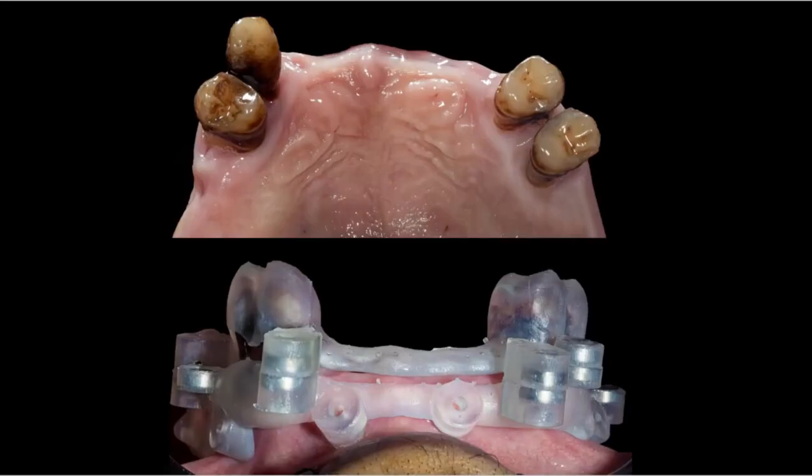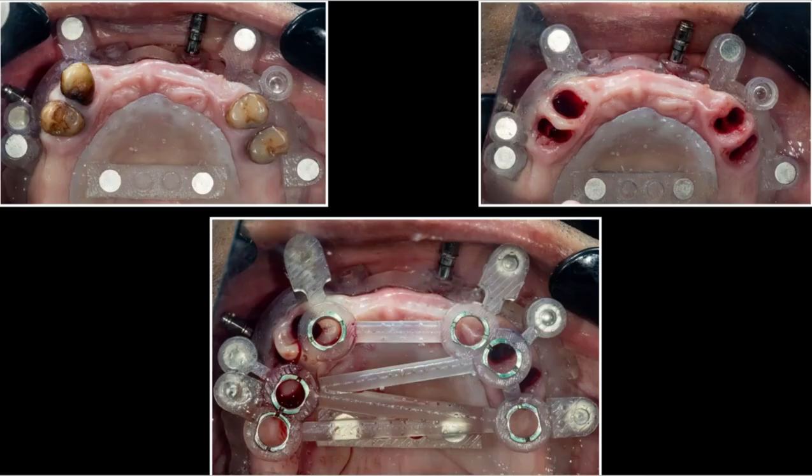These are clinical photos for the stackable guides in place. Usually stackable guides are used either when you need to extract all teeth and at the same time utilize them to make your foundation guide to support it, or make bone reduction before implant placement. And this is after extraction. Then we place the implant placement guide.